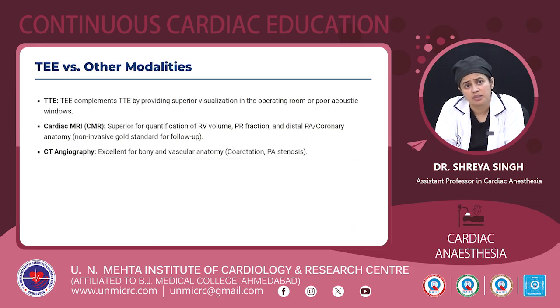Comparing TEE with other modalities. Compared with transthoracic echocardiography, it provides superior visualization in the operating room or in patients with poor acoustic windows. Cardiac MRI is superior for quantification of RV volume, the pulmonary regurgitation fraction, and distal PA or coronary anatomy, and it is the non-invasive gold standard for follow-up.